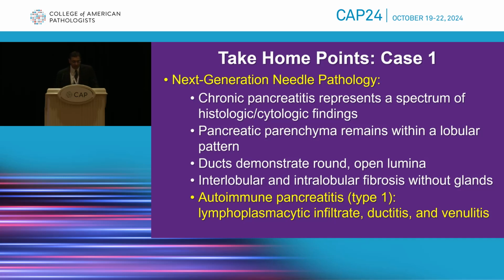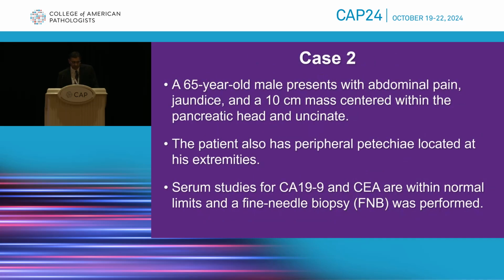Again, IgG4 can be used to support a diagnosis, but it doesn't truly make the diagnosis, and you can see IgG4 positive cells in the setting of pancreatic cancer. So just be a little careful of using the IgG4 to help you make that diagnosis itself.